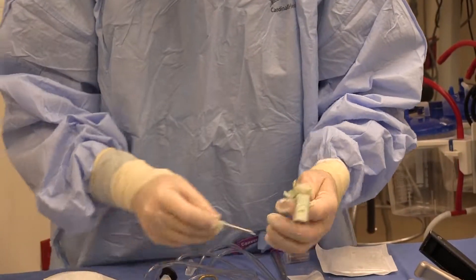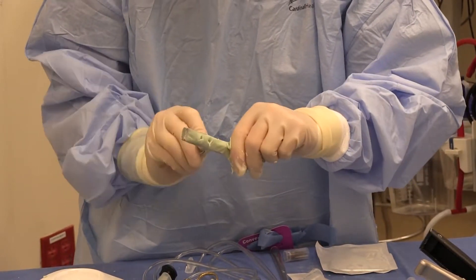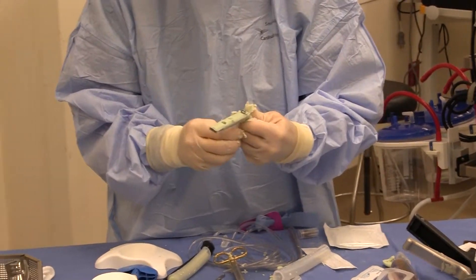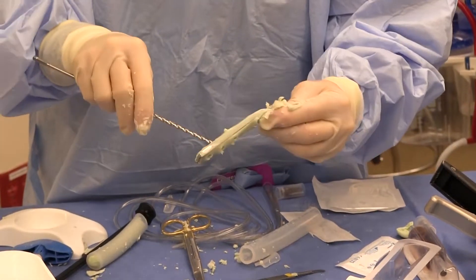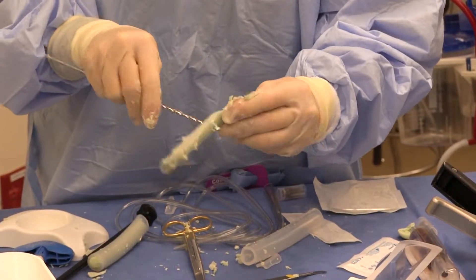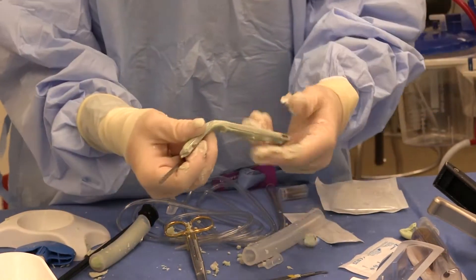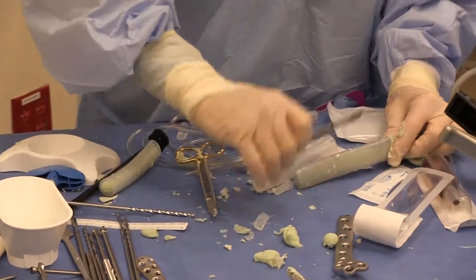Here I am just cleaning out my screw holes. The cement is getting hard, so at this point I will probably think about using power and a drill bit. I think I have most of my screw holes done — one, two, three, four — and then there's the blade. So this is one antibiotic-coated plate. We'll go back to this one and cut this off.